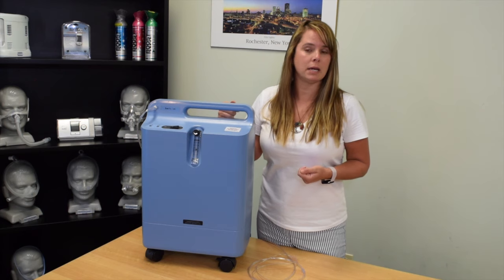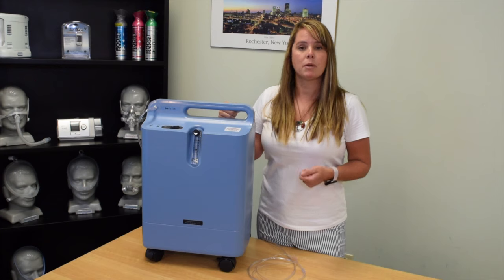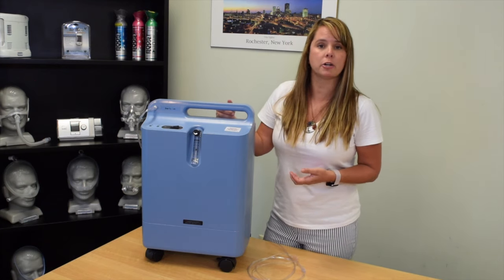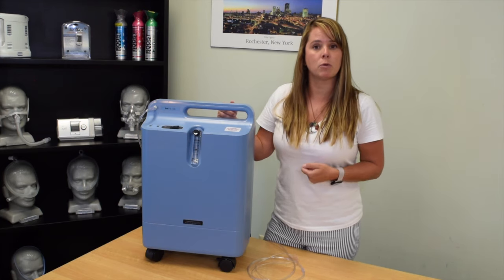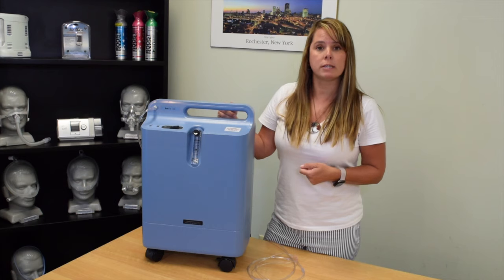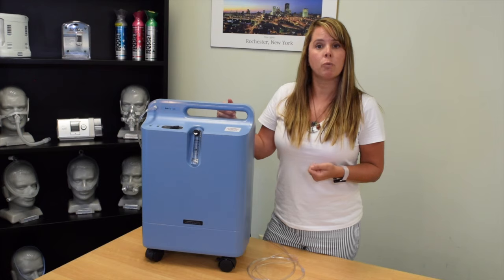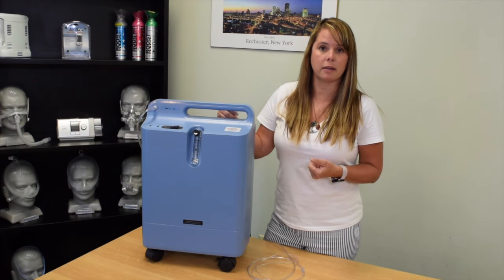If you anticipate it being out for an extended amount of time, you're going to want to relocate. But if the power is on in the home and you still do not have power to your concentrator, you're going to want to look at the outlet. Is the outlet on a switch and someone switched the switch? Or is the outlet just not working due to maybe a power surge? You'll want to go ahead and change the outlet and see if your concentrator turns on then.